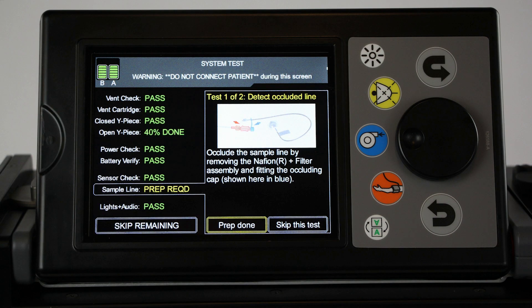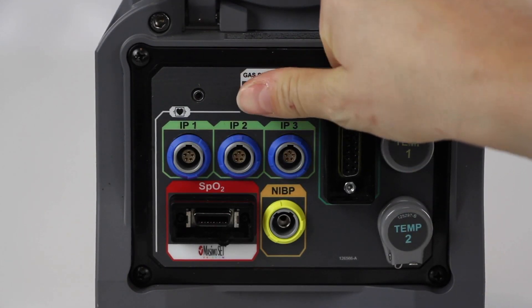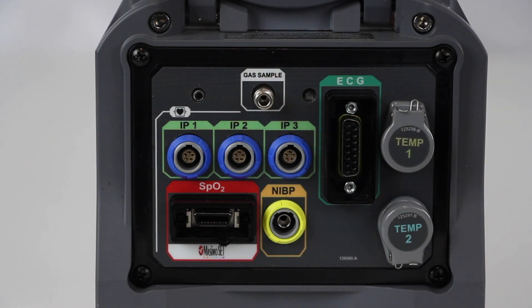The sample line test is comprised of two tests. To complete the Detect Occluded Line test, occlude the gas sample port on the patient connections panel at the front of the device with your finger until the test is completed. To complete the Verify Clear Line test, remove your finger from the gas sample port and leave it open.